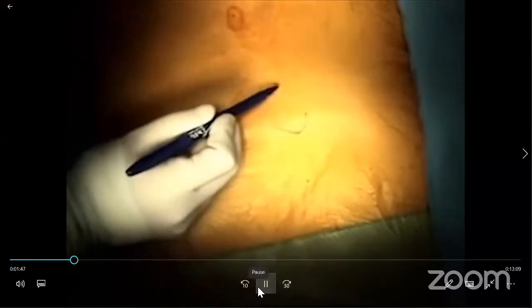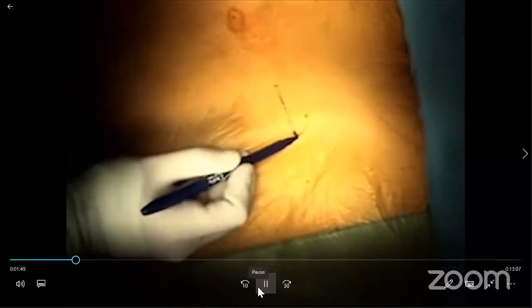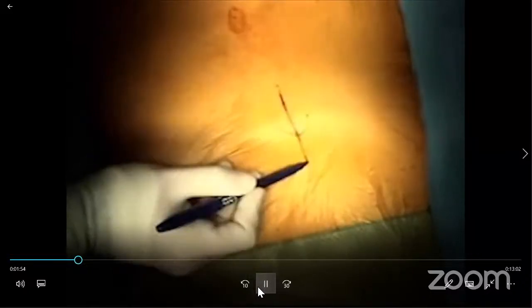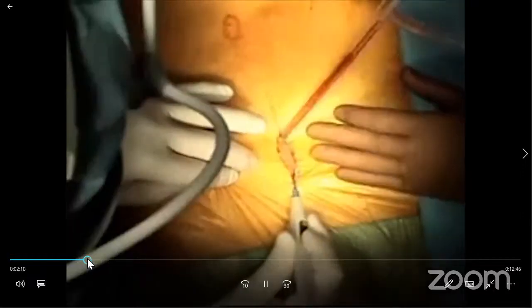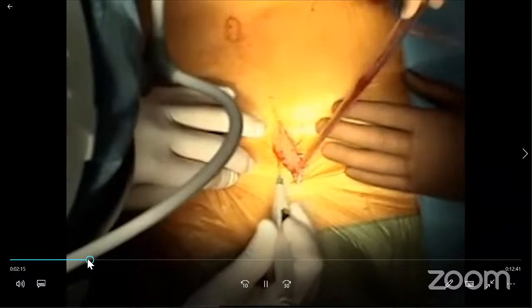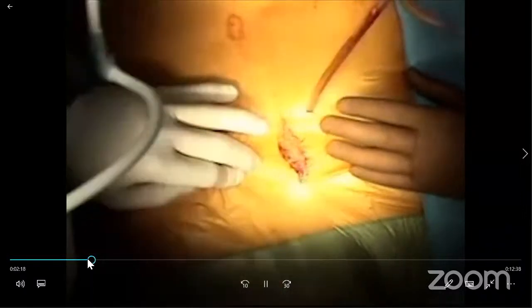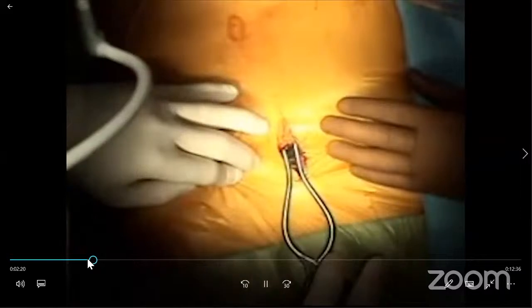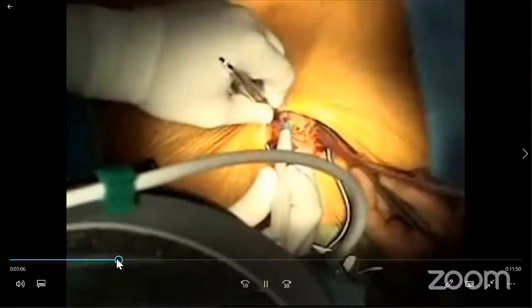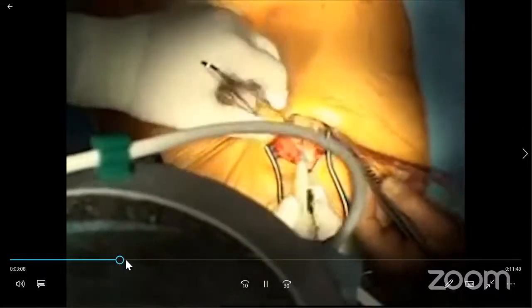So this, there is a marking of the incision. Then a short vertical incision about 5 to 8 centimeters long is made over the xiphoid, extended into the midline of the abdomen, and the linea alba is incised. Then we can see after that, we should incise or completely remove the xiphoid.